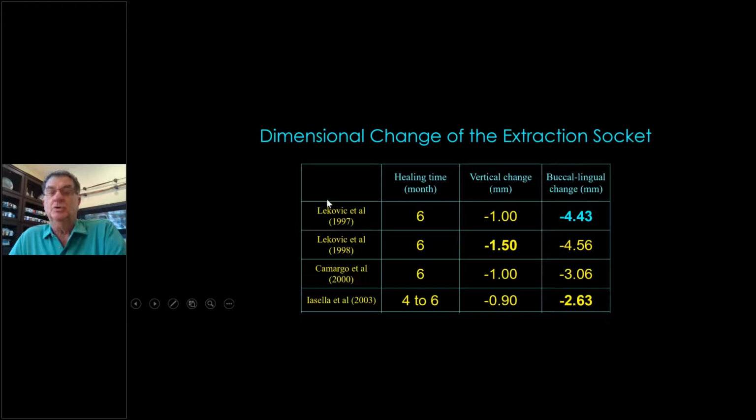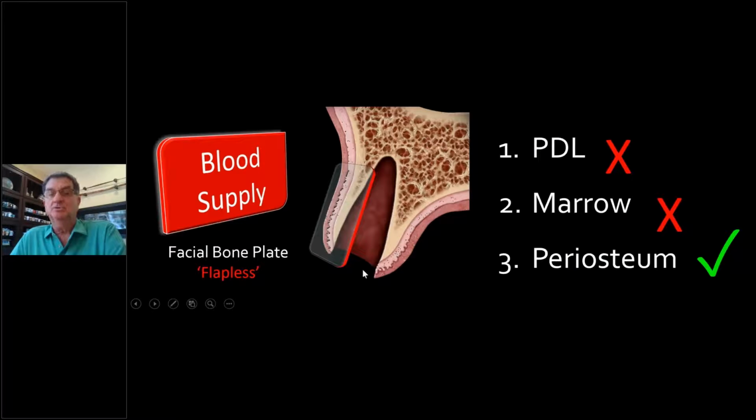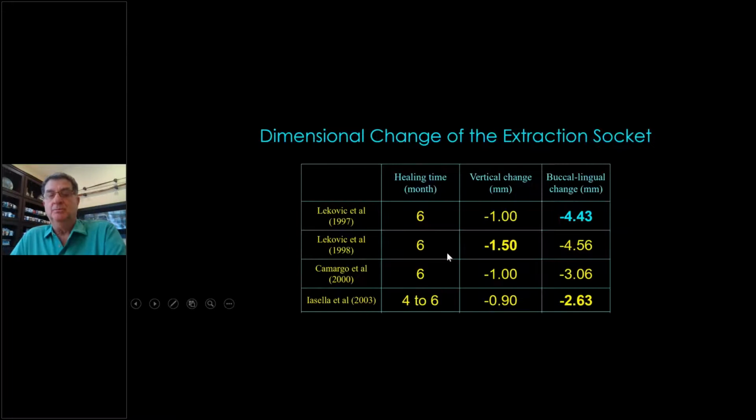This is what turned me off originally to immediate placement. The vertical change in the ridge wasn't so bad height-wise. And why is that? That's because the palatal bone back in here, see, is thicker and holds the ridge up. So that's the key there. So that's what holds the ridge up. But look at this thing.